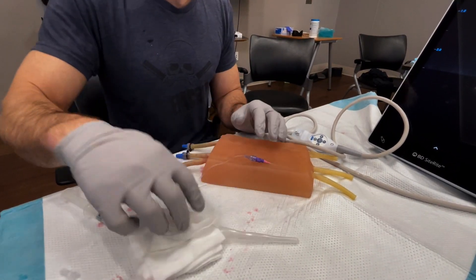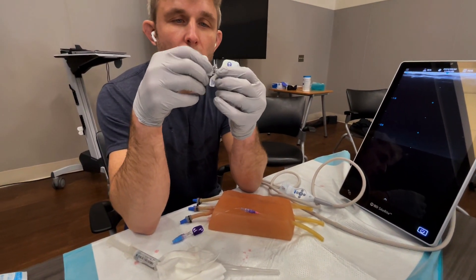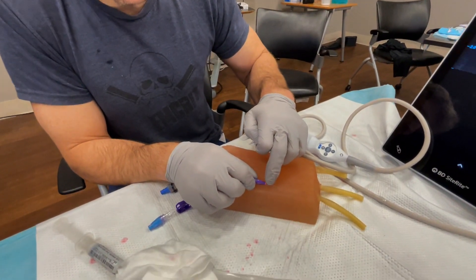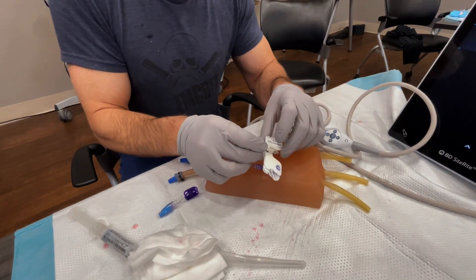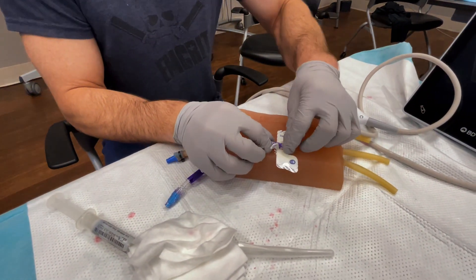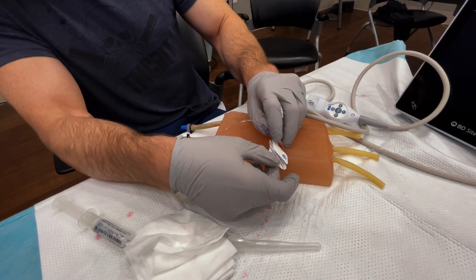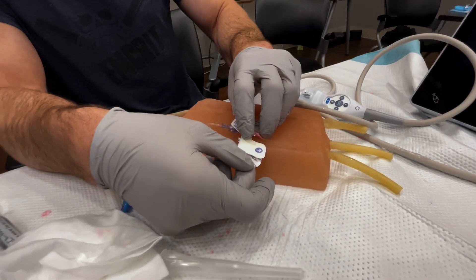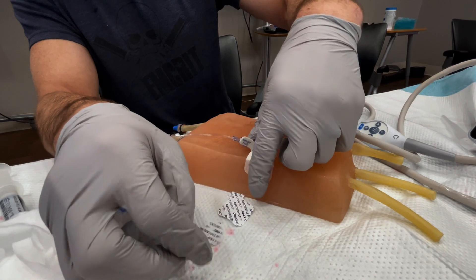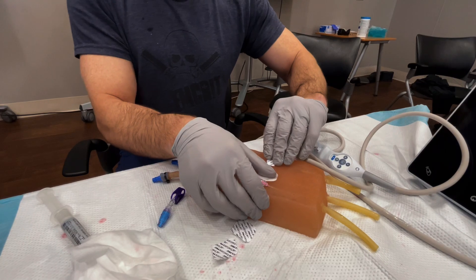The final key is securing it in place. These adhesive securement devices have two little wings or bumps on the sides. If you look at the pink portion of your catheter, you've got two little knobs on the outside — those two things should come together. Make sure they're in line, then push down on the securement device until you feel it click. Once clicked, those two things are locked together. Now I can secure it to the patient: grab the stat lock wings, pull them out on each side, and we're in place.